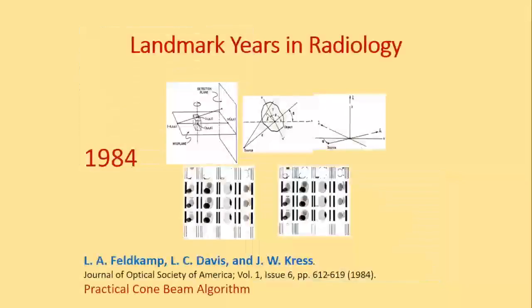And why am I teaching about Ford today? That's because of, again, these three gentlemen, Feldkamp, Davis, and Kress, and mark the year 1984. I personally believe, again, this is the second biggest landmark year in radiology. And why FDK? Because that's called the FDK algorithm on which the CBCT is literally based today. All the machines that we have today have this backbone of this cone beam algorithm proposed by these three guys, Feldkamp, Davis, and Kress.